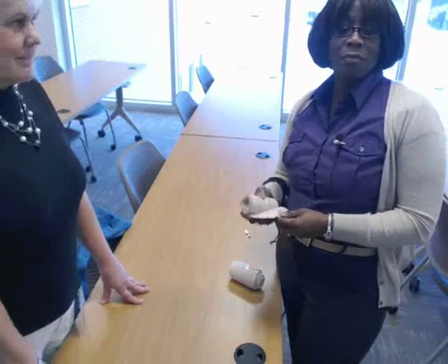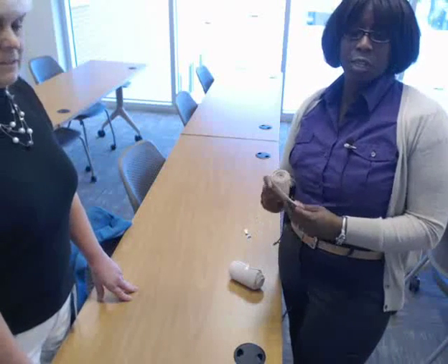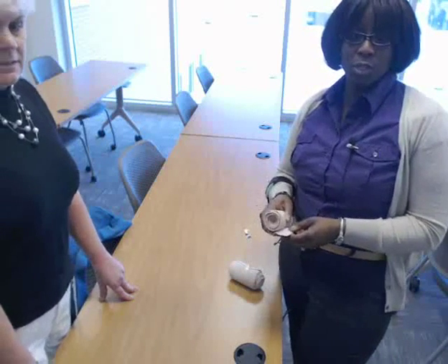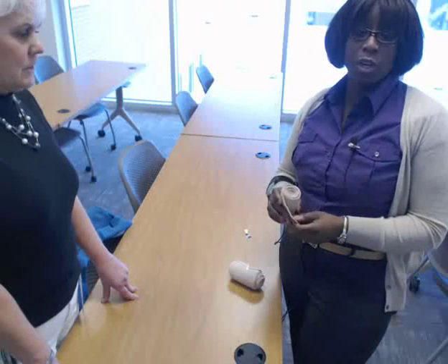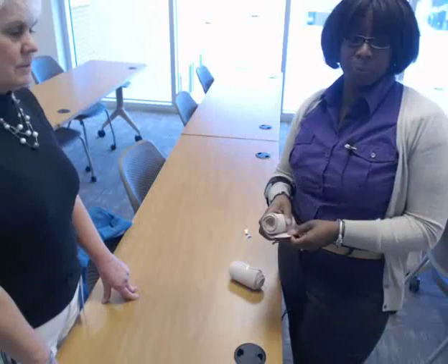Hi class. In this video I'm going to show you how to do some bandage wraps. We're going to go over the circular turns, the spiral turns, recurrent, and also the reverse spiral.